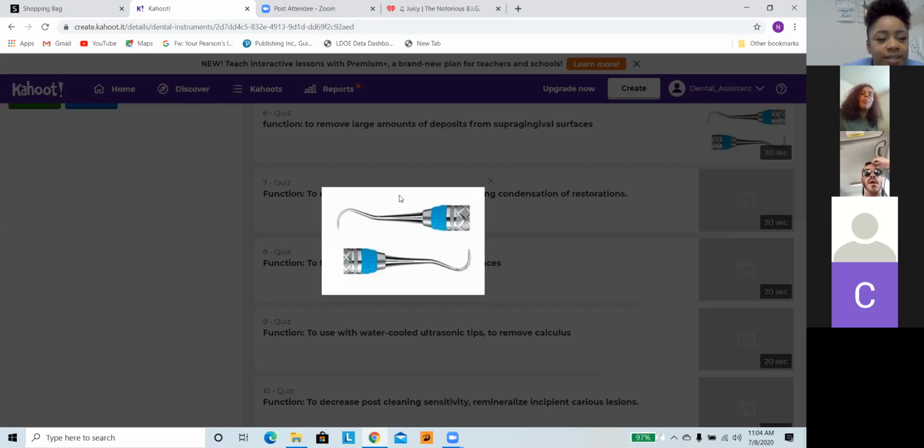What procedure is that on? It's like an electric drill, I think, but I don't know the name of it. Okay, you're getting somewhere, Michael. So remember, let me call the trays out. We have our Profi tray that we use for cleaning the teeth and giving the patient a clean smile. We have our fillings, amalgam and composites. We have crown and bridge to give that person that full crown back. We have oral surgery where we're removing teeth.